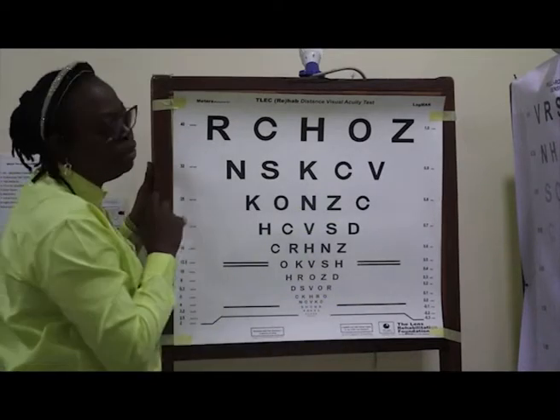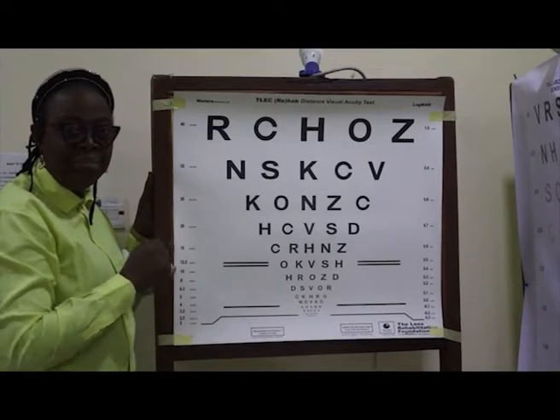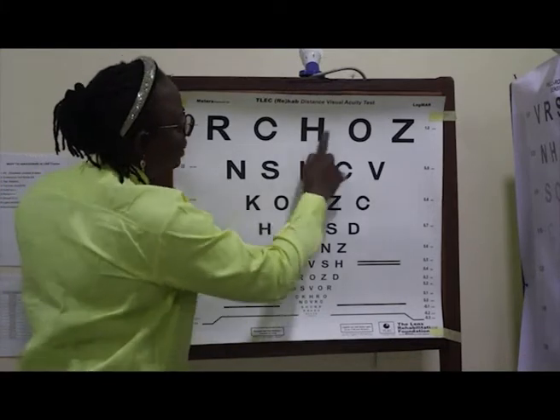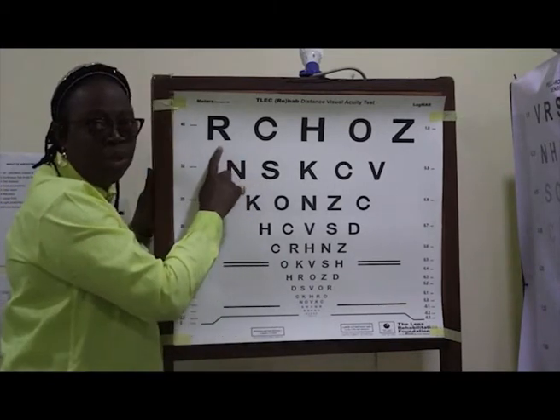The higher the value that you get, the worse the visual acuity. The lower the values that you get, the better the visual acuity. Each line has 5 letters, and each letter represents 0.02 LOGMAR.